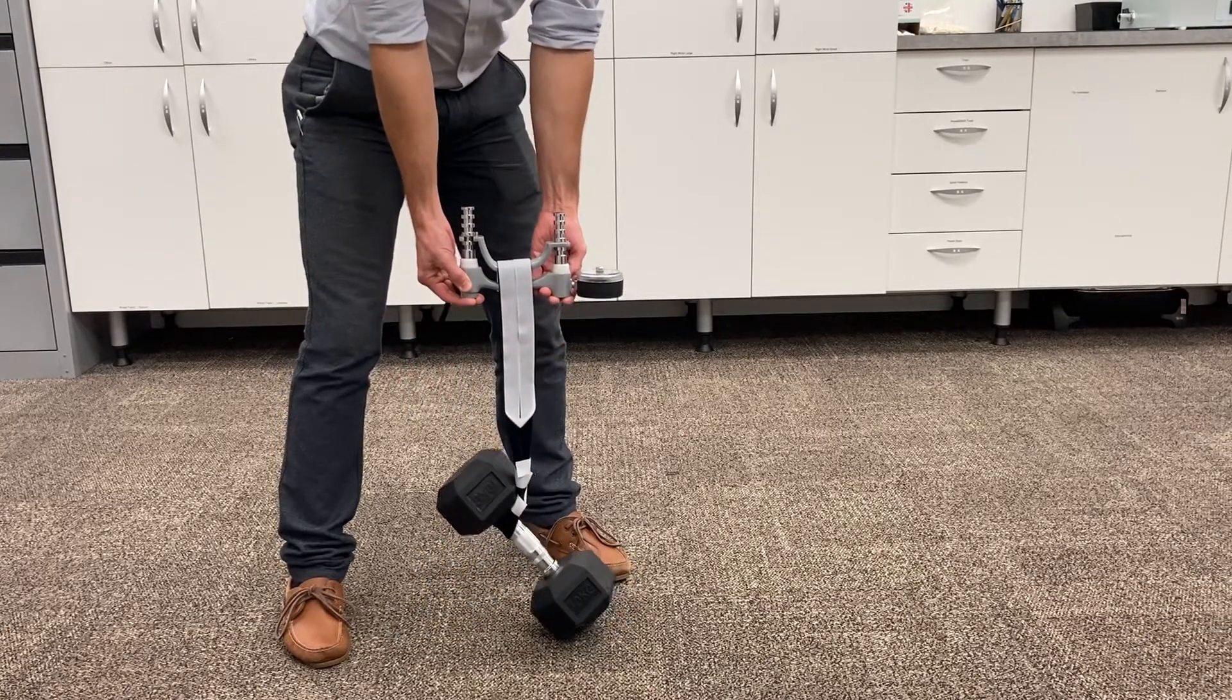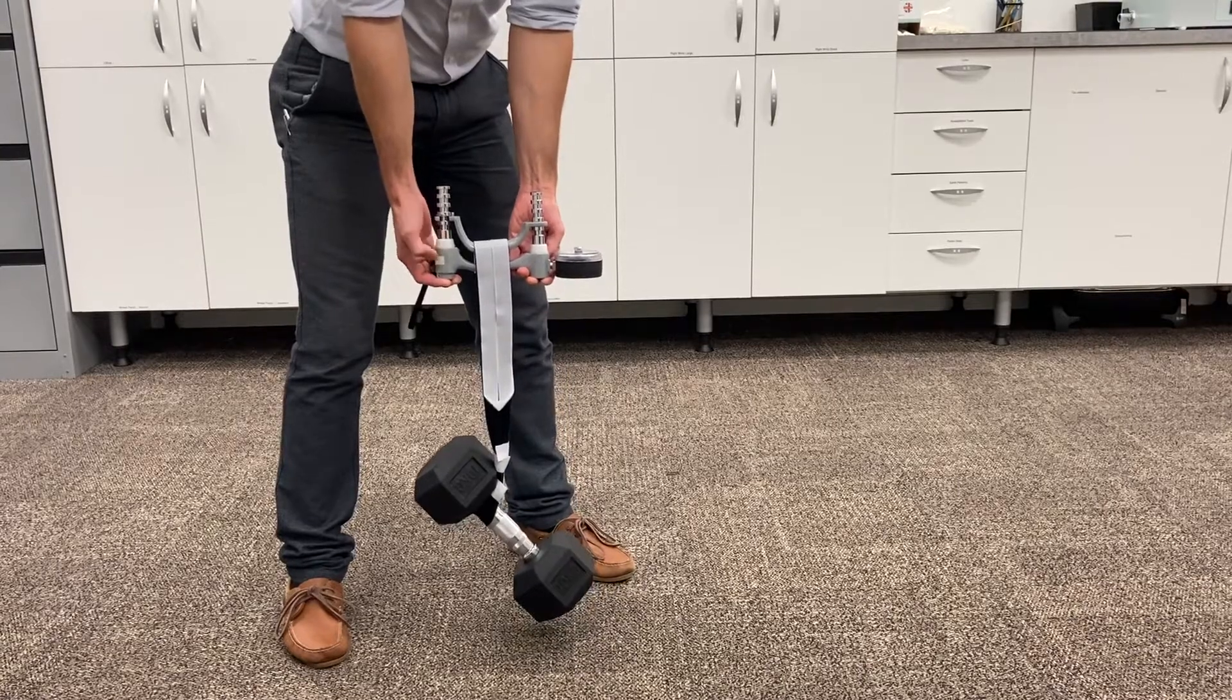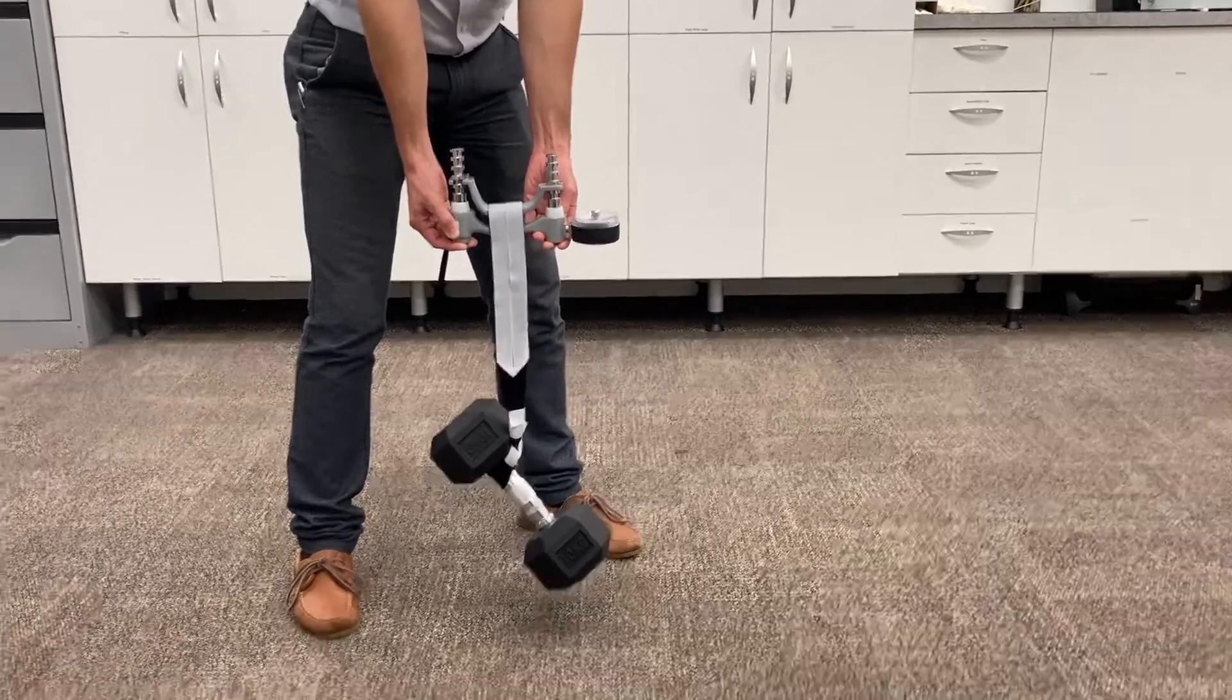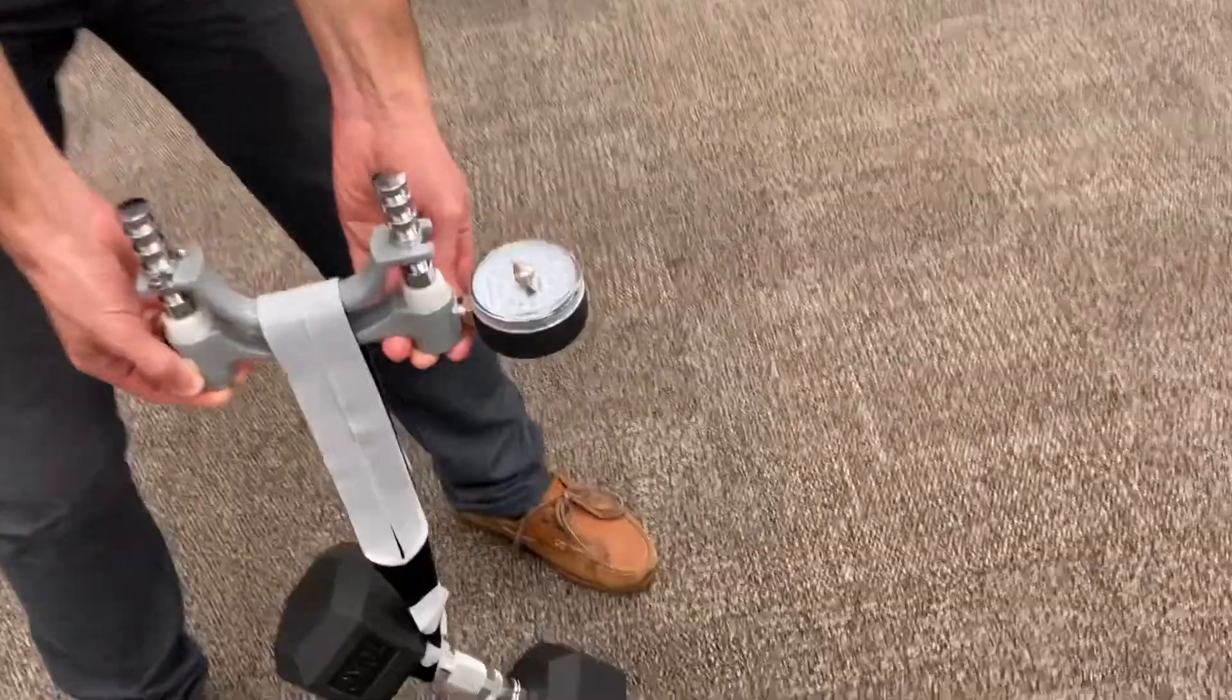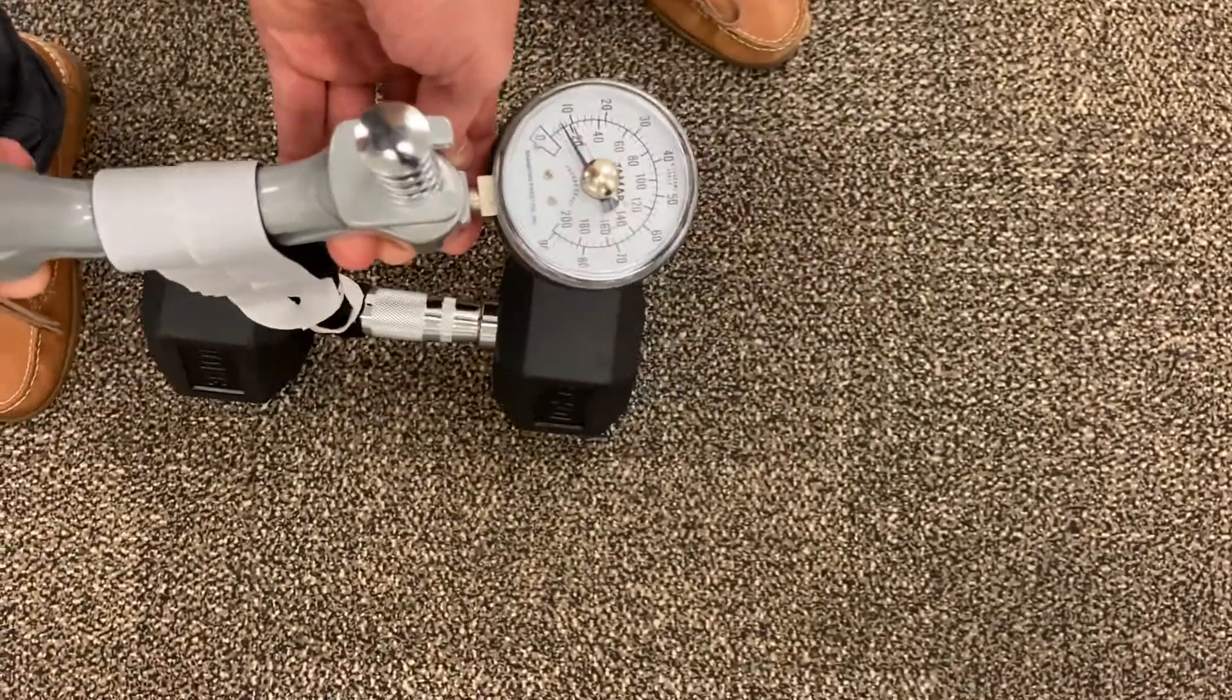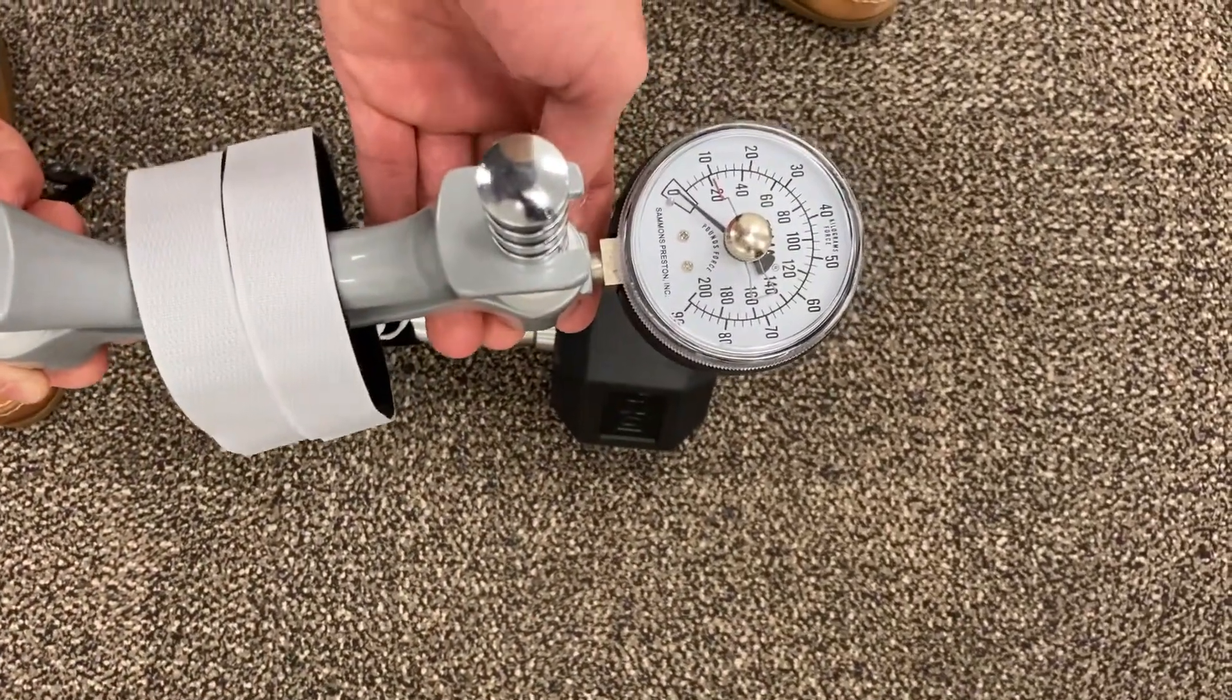We're not putting any pressure onto the two poles with our hands. And then if you come over and have a look, it's spot on 10 kgs. And we bring it back down and it goes back down to zero. So that's how you can test it against the known weight.